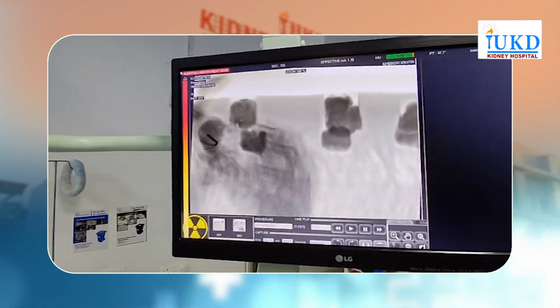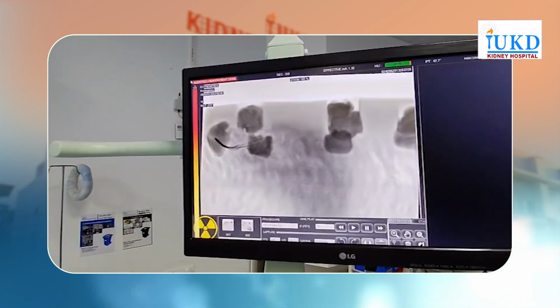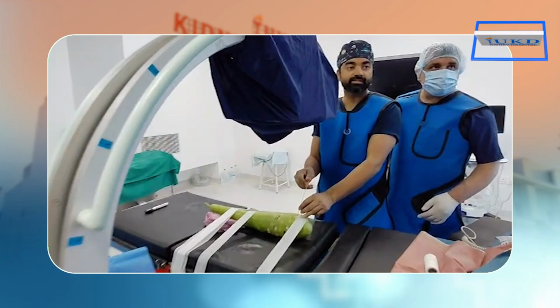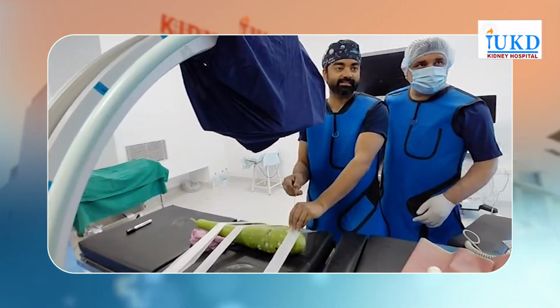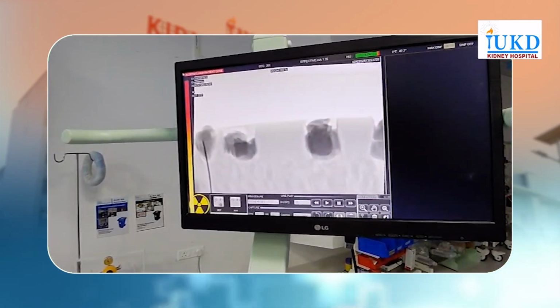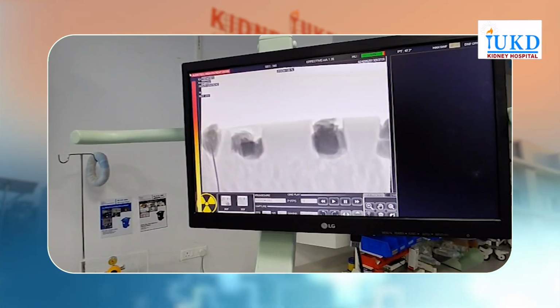Okay, and if you want to see that, I can move the cotton. You can see. Okay, the cotton can be moved. Can you see the movement here? Okay, make it 0. Adjust in 0. See, I'm right at the target. So suppose I was a little behind, the angle still remains the same. So I'll just go deeper. See, the cotton is coming out. Can you see?